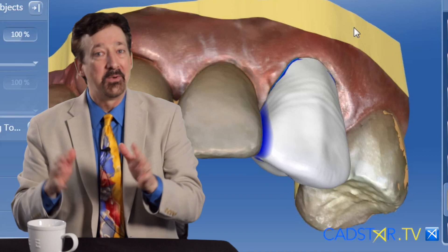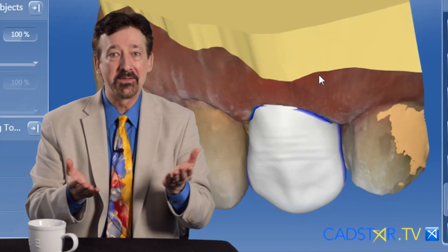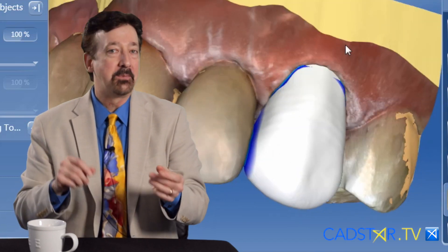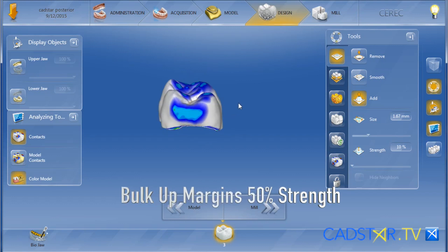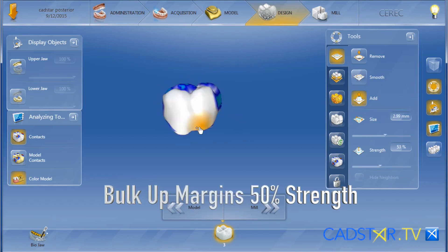So the form tool, which is one of my favorite tools, is on par with the shape circular two direction. You want to use it carefully. I'm mainly going to use it to refine my interproximal contacts and bulk up my margins or smooth the margin if I need to, but keep that smooth tool away from the other elements on the facial and occlusal surfaces. You don't need to smooth those areas. I know it's a natural thing to do, but stay away from fiddling.